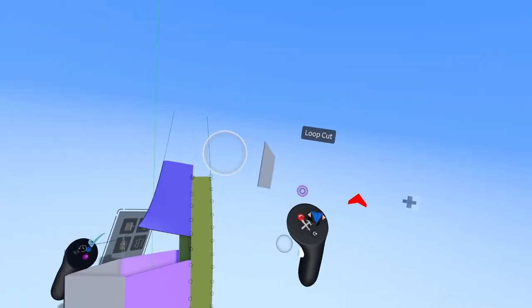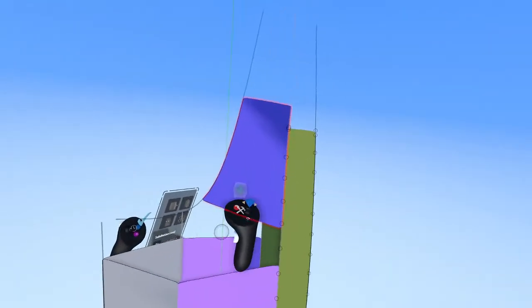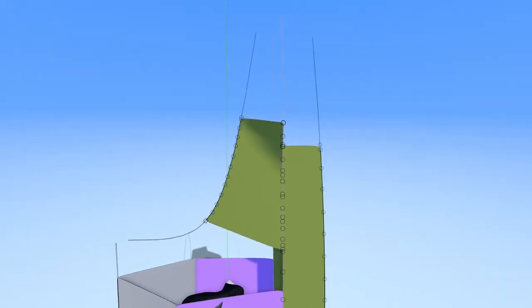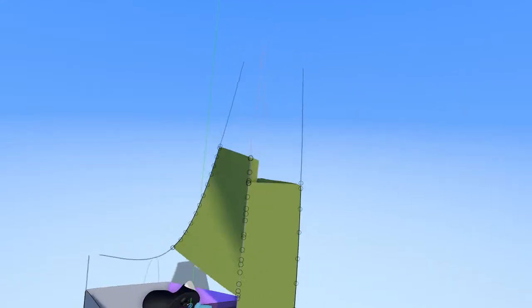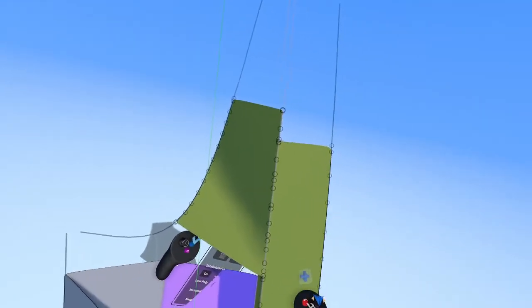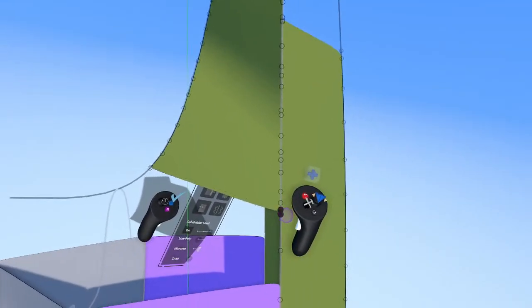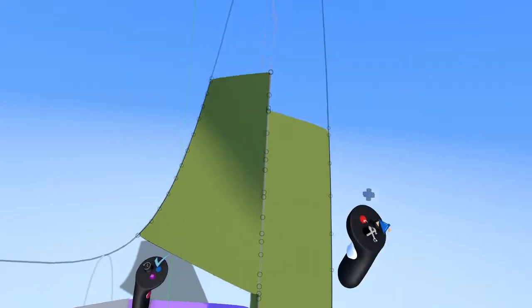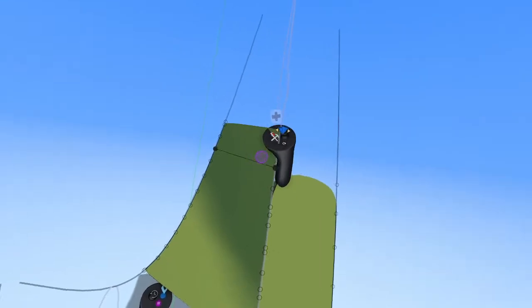So you only have access to these tools when a piece of sub-D geometry is in edit mode. Select the merge tool, point and click, and now it will change the material type and the shading and the color of that other surface, and it will give you the edit points. So now these are the same surfaces. They might not be connected yet, but they are the same surface. And so now what we can do is actually play this really simple game of basically connect the dots.